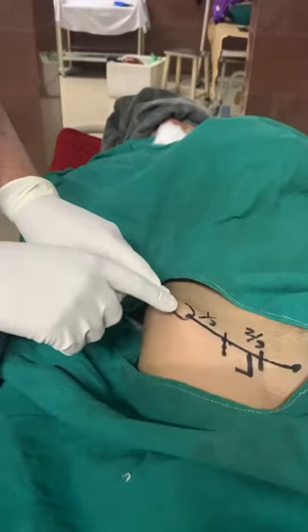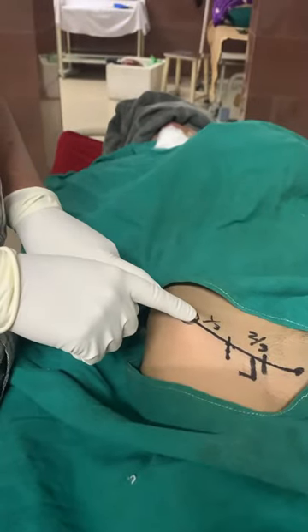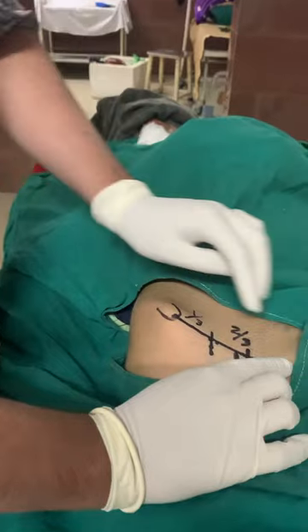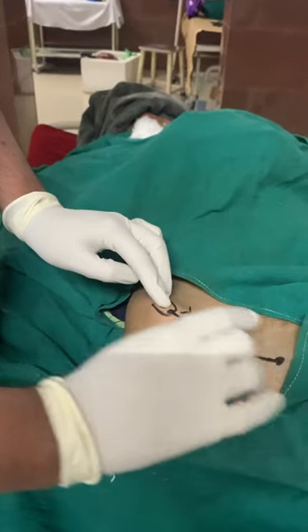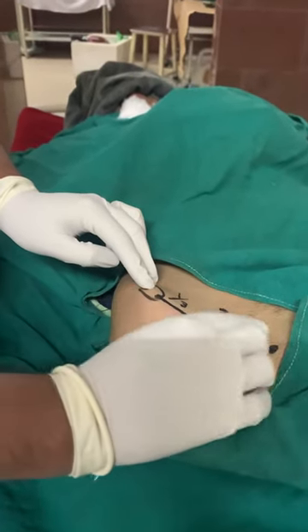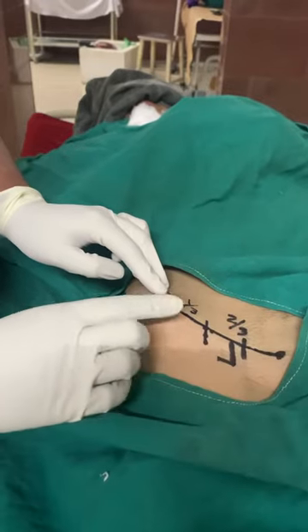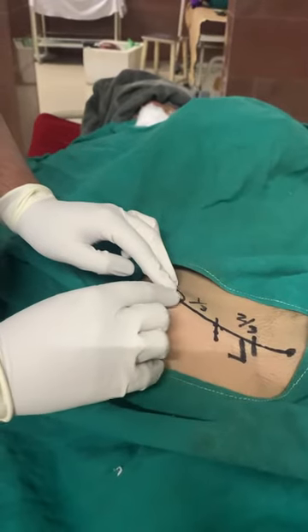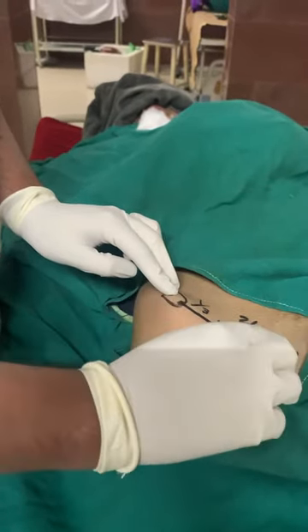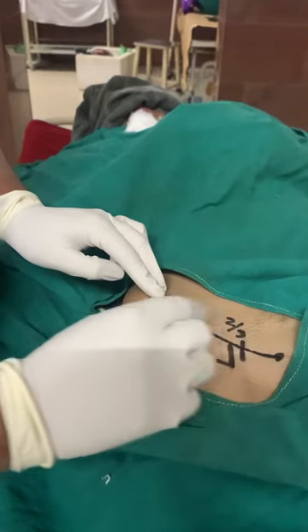First, we will identify the anterior superior iliac spine and the pubic tubercle. Between the anterior superior iliac spine and the pubic tubercle, we will put a line. Then we will divide this line from the anterior superior iliac spine to the pubic tubercle into three equal parts.